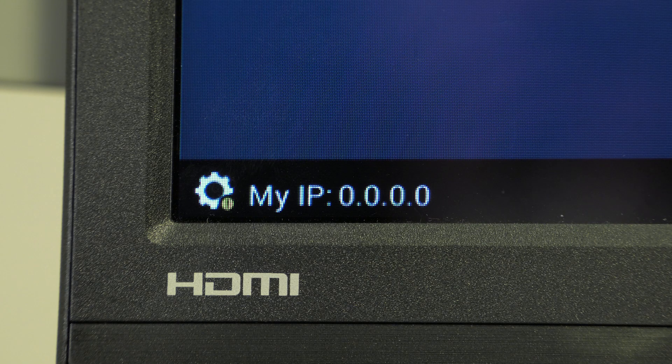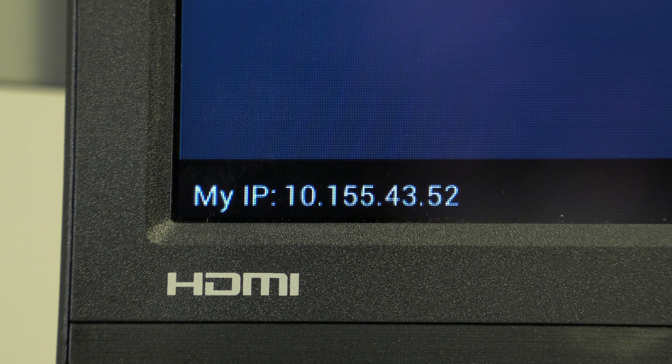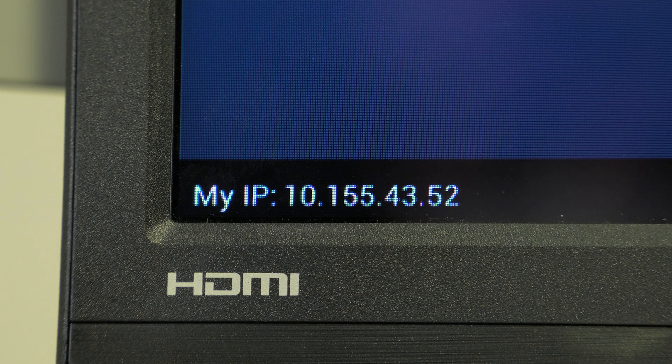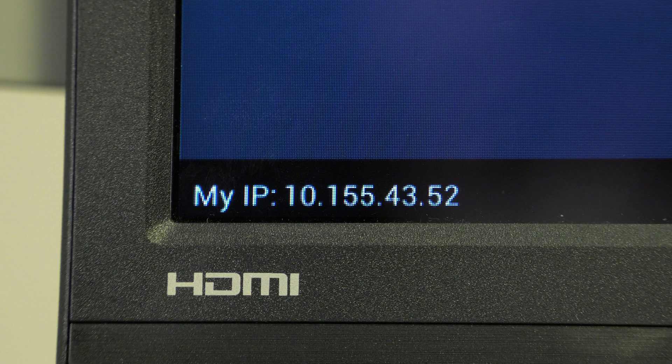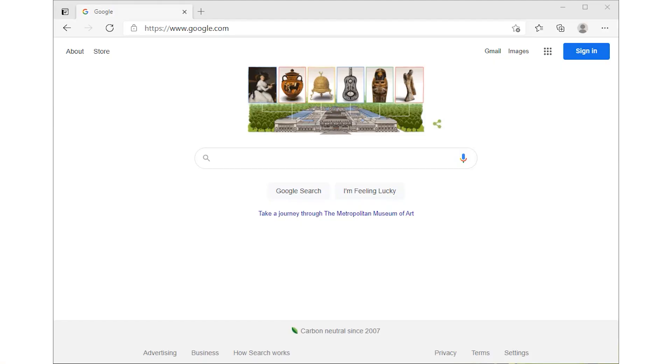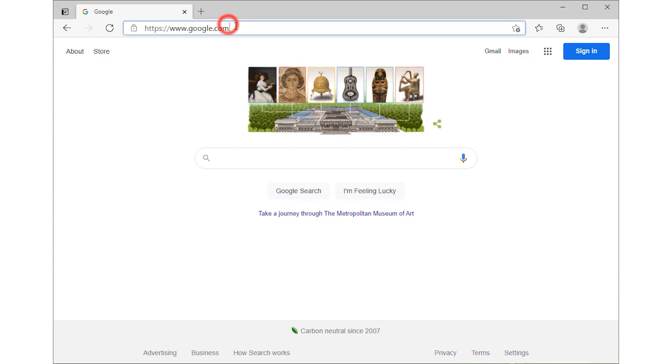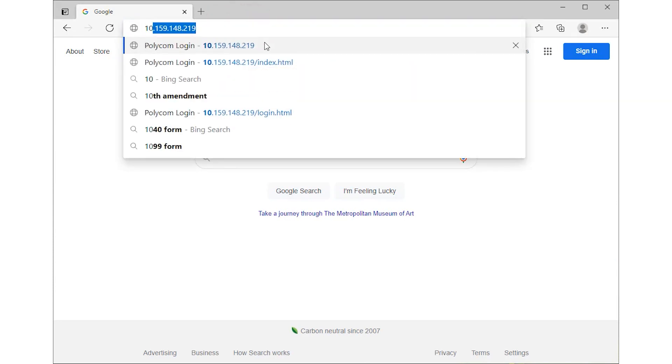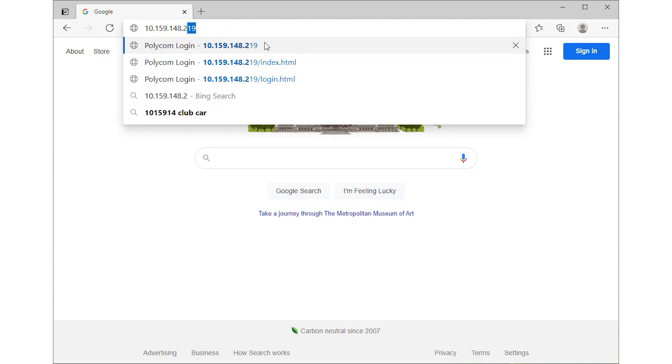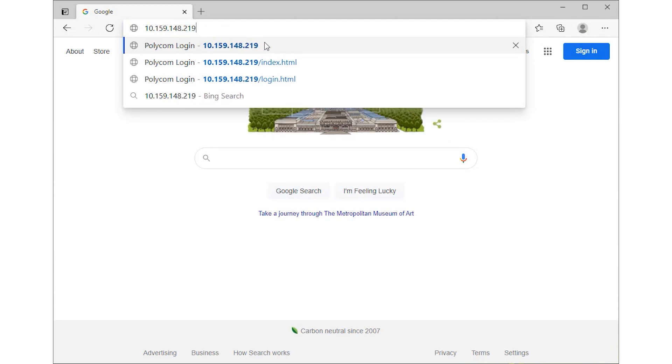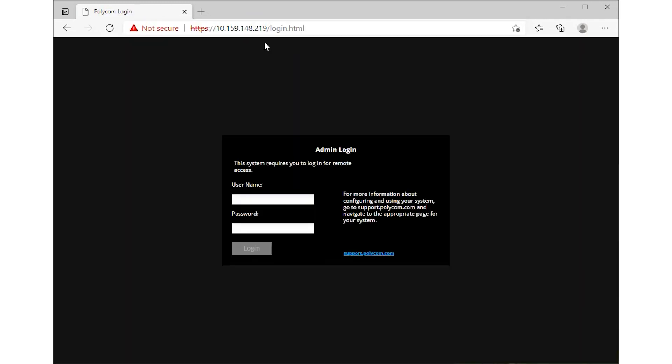To access the web interface of the Polycom unit, ensure that the cart is connected to the internet with an IP address displaying at the bottom left of the main menu. On a desktop or laptop on the same network, open a web browser of your choice and enter the IP address of the Polycom unit in the address bar. Hit Enter and the web interface of the Polycom unit will load.